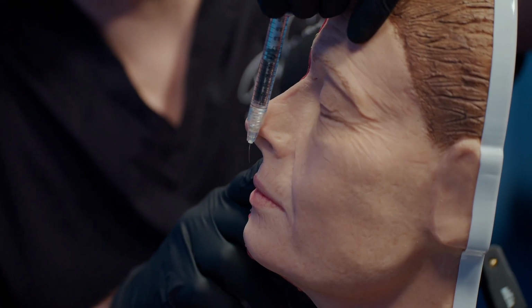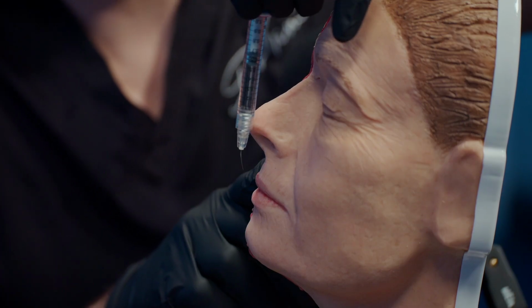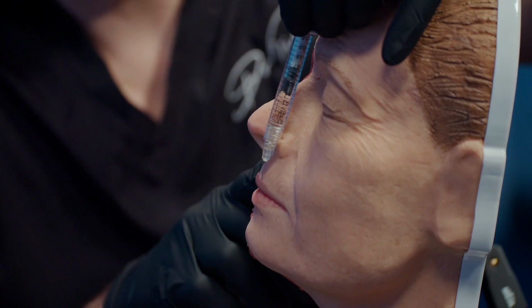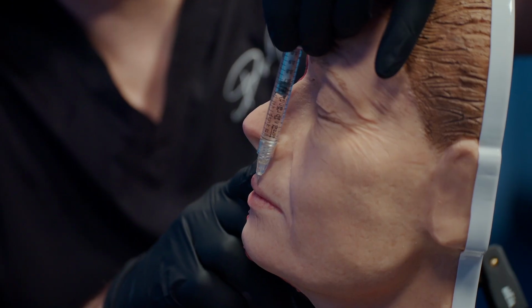If you don't have the bend, you can still do it, but you just need to move your needle outwards. And it gives your brain a little bit more to think about than when you have the curvature. So the curvature should be a relatively gentle curve, and it enables you to hold that depth as you slide in more accurately.